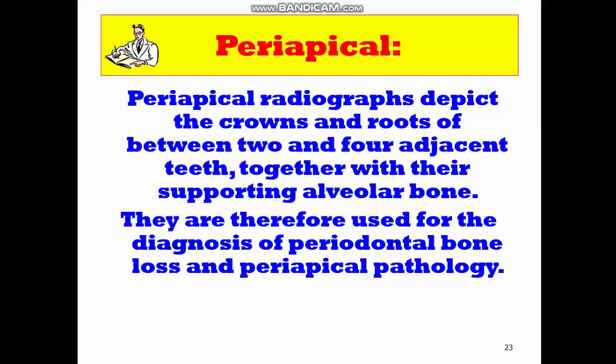There has been a long-standing requirement for dental students to understand the basic techniques for intraoral periapical radiographs. Intraoral periapical radiography is an adjunct to the clinical examination and provides useful information about the different components. The periapical view shows the entire crown and root of the tooth, which provides vital information to aid in the diagnosis of the most common dental disease.